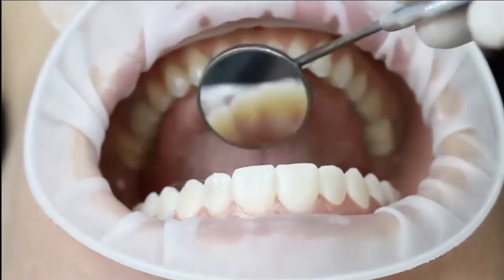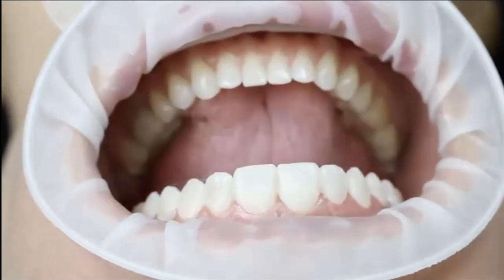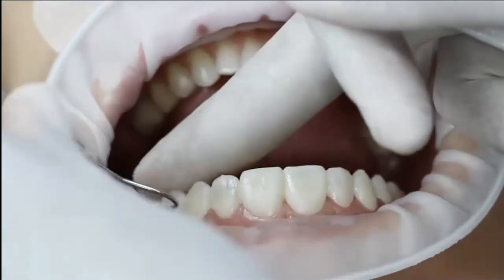Then, of course, check on the palatal area, check if there is any excess. If there is any excess, remove it with any type of instrument, an explorer or anything.